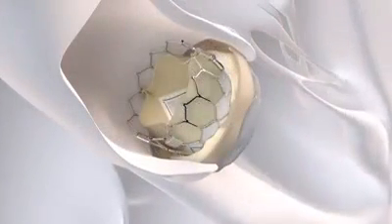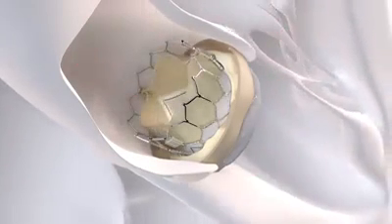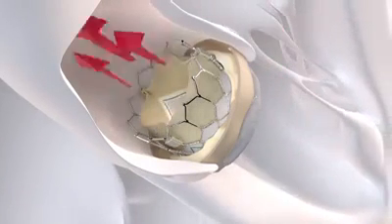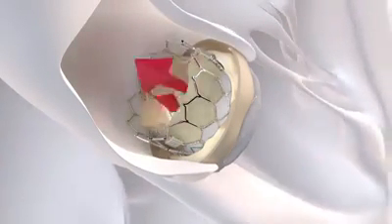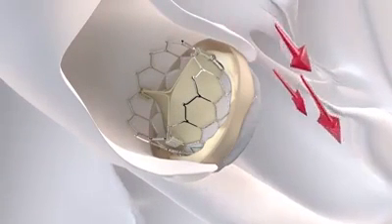Once in place, the SAPIEN 3 valve begins functioning immediately, with the leaflets opening and closing to pump blood to the rest of your body. The most serious risks of the TAVR procedure are death, major stroke, major vascular complications, and life-threatening bleeding.